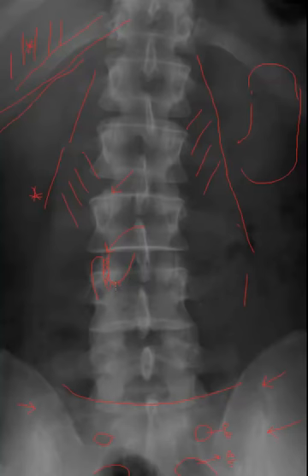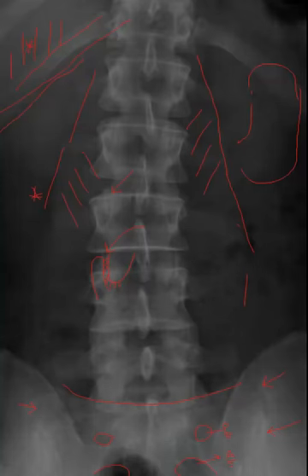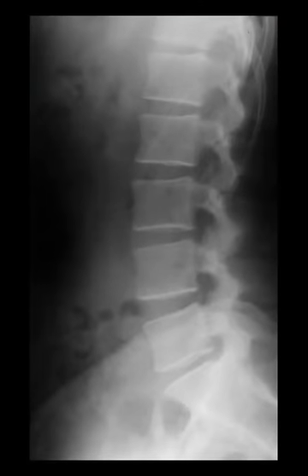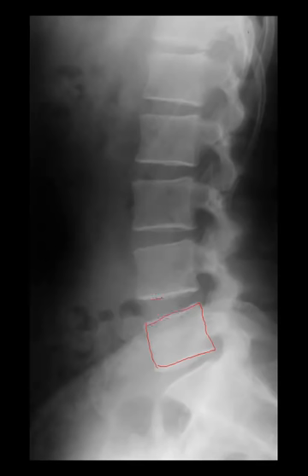We're now going to move on to the lateral projection. Here is the lateral projection of the lumbar spine, in which we can see the lumbar vertebral bodies very nicely. The vertebral segments are visualized here with the vertebral body, inferior end plate, and superior end plate clearly identifiable.